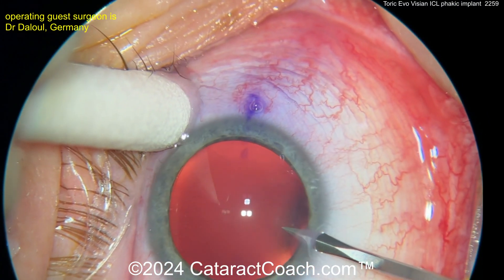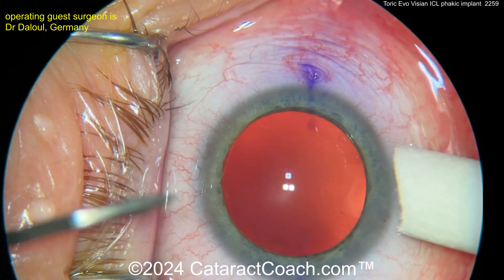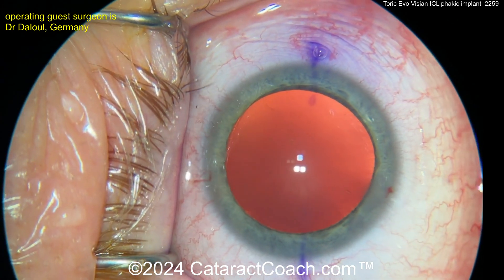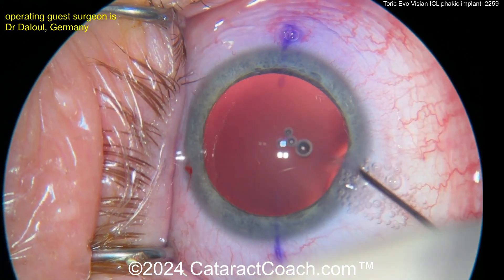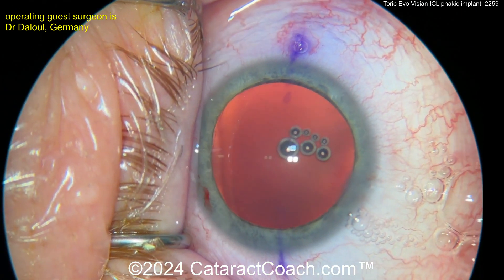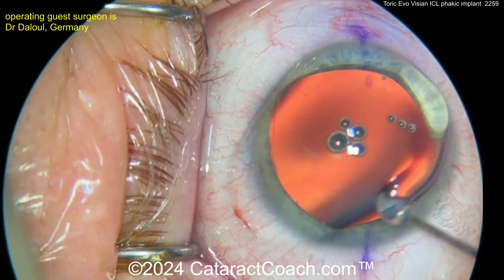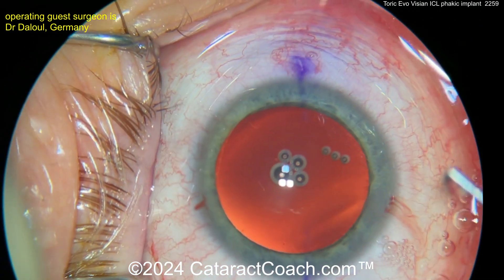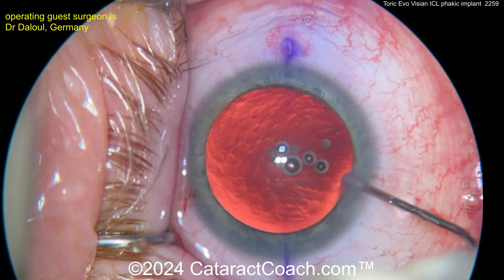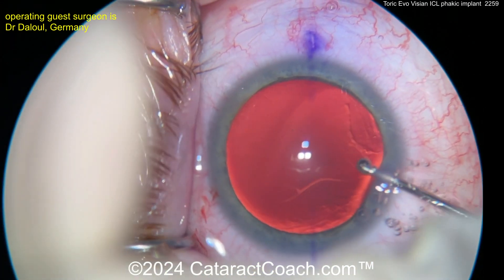Here's our patient. Making a paracentesis and another paracentesis. Remember, this patient has markings on the cornea for the axis where you're going to orient the Toric ICL. The anesthetic can go inside the eye, and there's some HPMC — hydroxypropylmethylcellulose — that's the preferred viscoelastic, sold in the USA as Ocucoat. Get a nice fill of viscoelastic here.